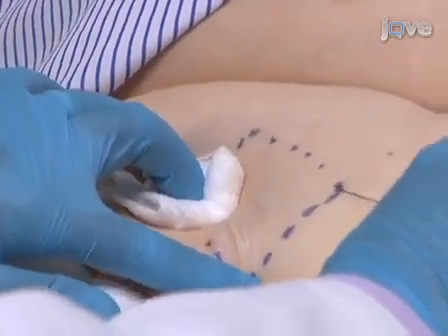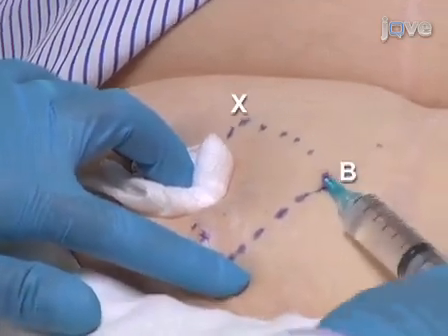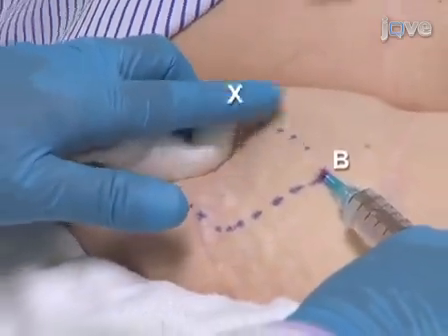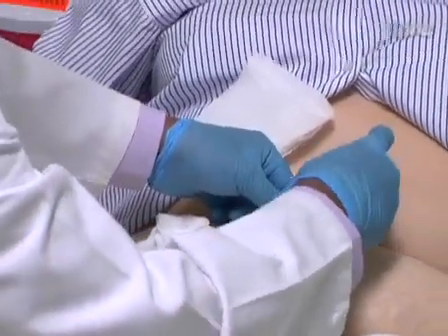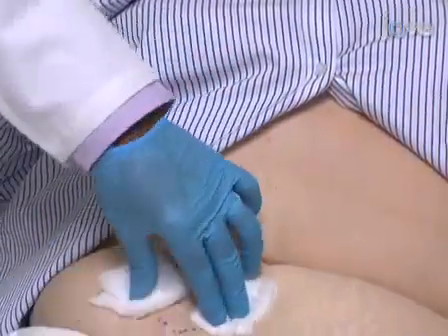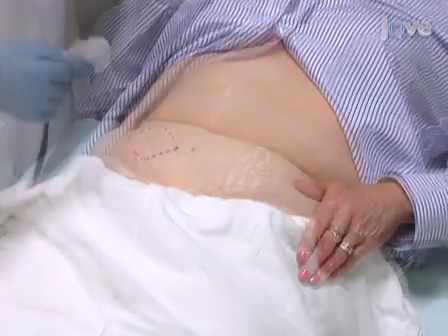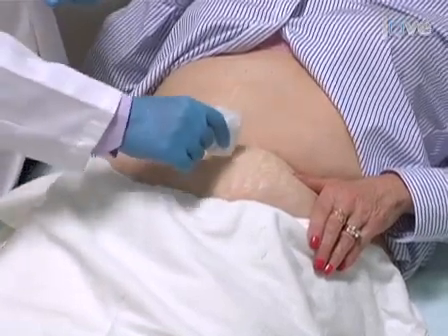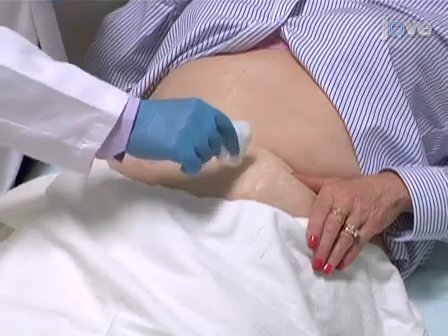Starting from point B, repeat this process, dispensing lidocaine subcutaneously from point X to point B, then from point B to point Y. Again, apply gauze to prevent bleeding. Check that the area is anesthetized by lightly touching the skin within the rhomboid with the corner of a cotton gauze piece and comparing it with the adjacent, unanesthetized skin.